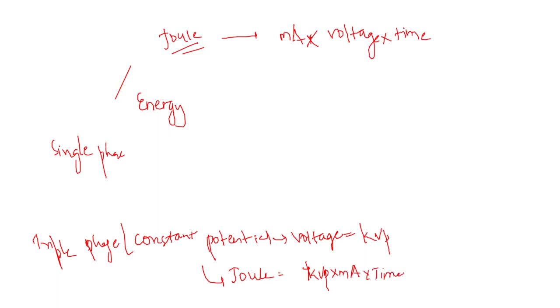Whereas in single phase, if you remember, if you multiply average voltage with 1.4, we'll get kVp.